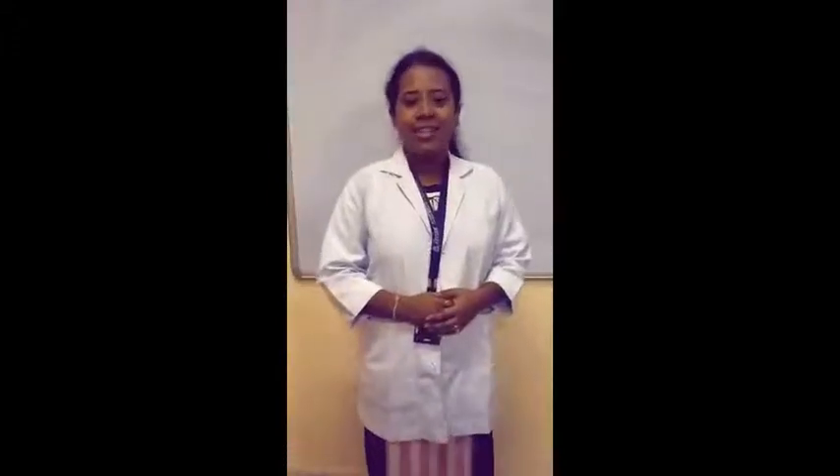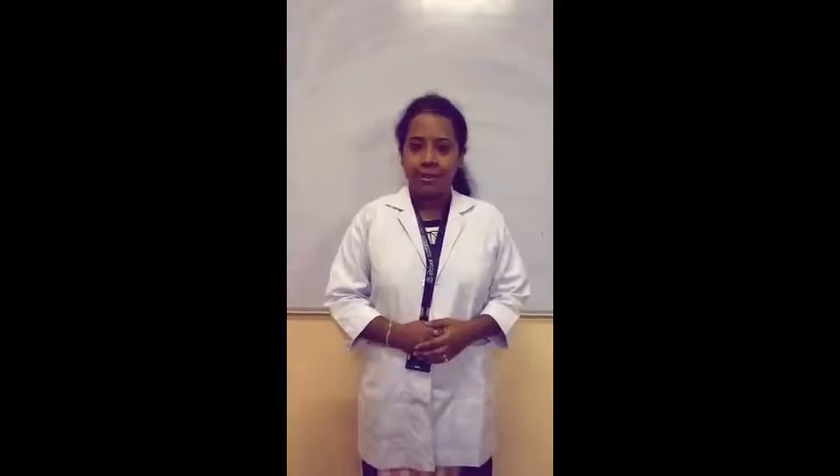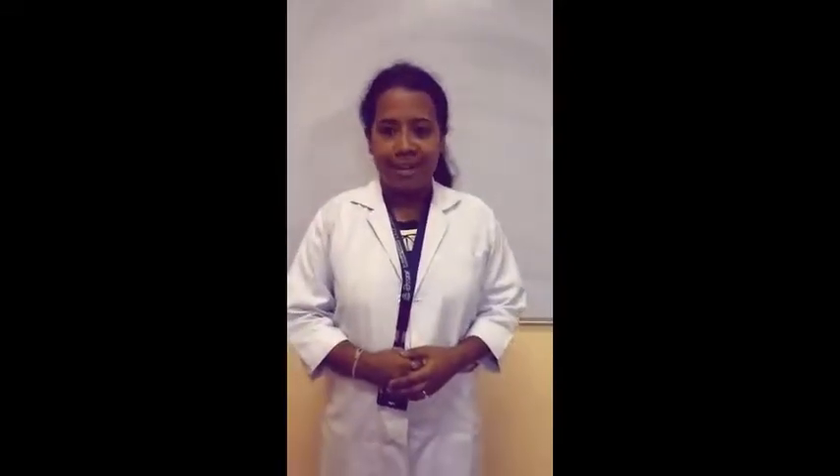Hello everyone, in this video I am going to demonstrate how to use the walker safely when the patient has any type of injury in one leg.